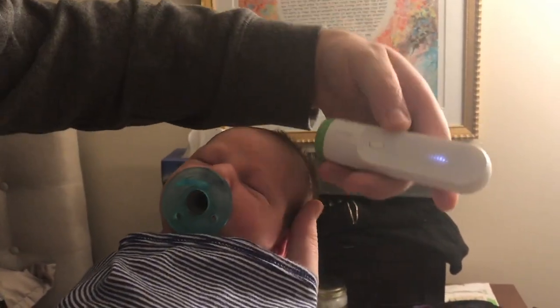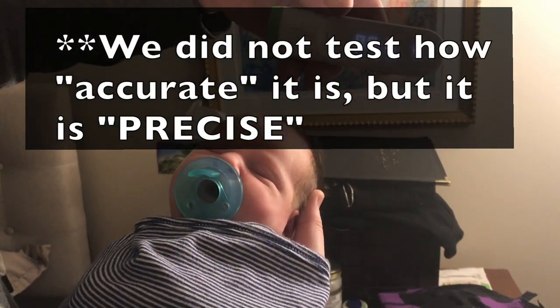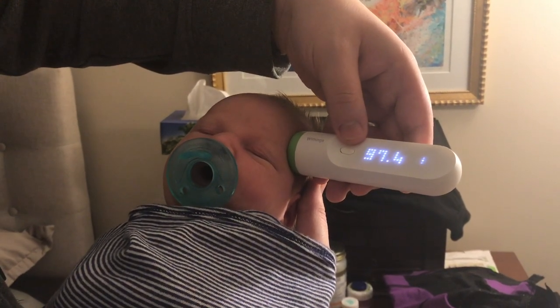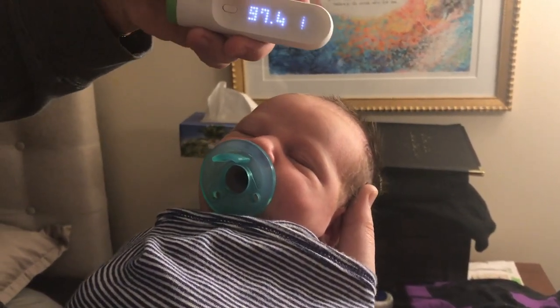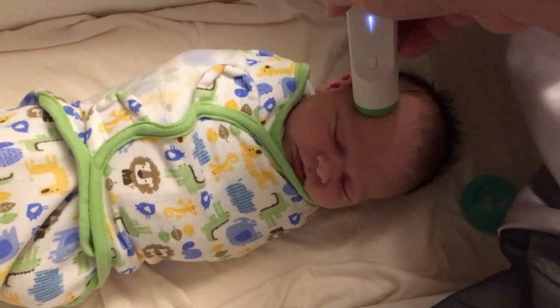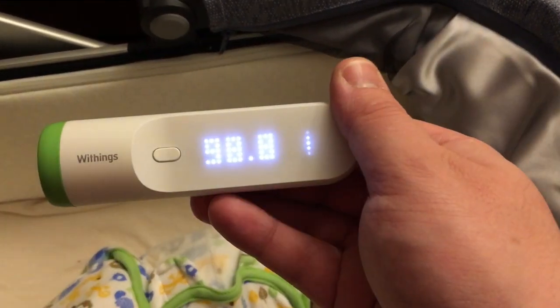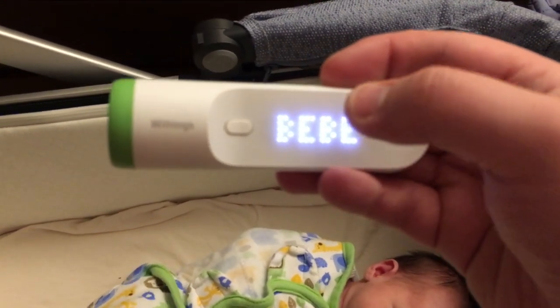So it's looking pretty accurate. It's a much easier way to measure temperature on a newborn — very quick. Don't need to stick something in their armpit, and pretty consistent. And being so easy to take measurements, you can even do it when your baby's sleeping, which is really great because sometimes you need to get that temperature and it's easy if you don't need to disturb them.